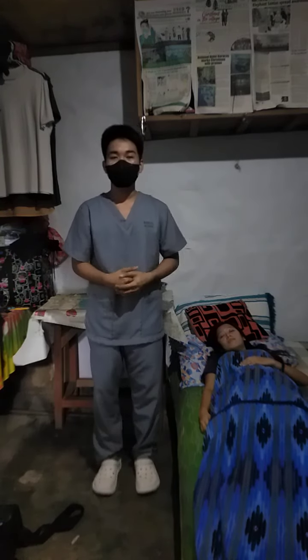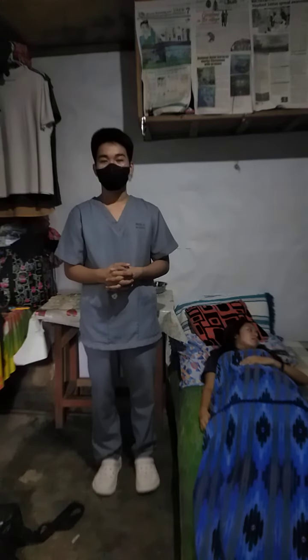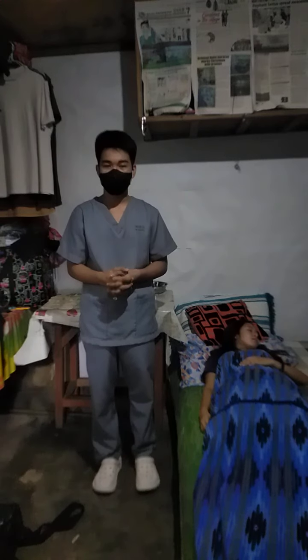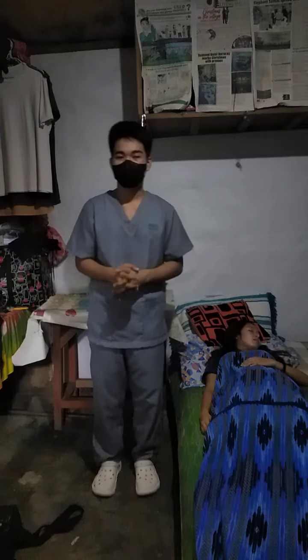Perform hand hygiene and put on PPE if indicated. PPE is required based on transmission precautions while hand hygiene prevents the spread of microorganisms. So assuming that I already did those, next is to identify the patient. This ensures that the right patient receives the intervention and helps prevent errors.